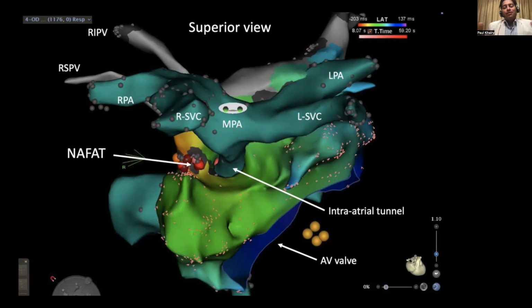So I hope that this gives you some idea of how these procedures are done, from initial importation of CT scan or MRI images to connecting the catheter, to controlling the catheter, to the retrograde aortic approach, to merging the images, and a catheter ablation.